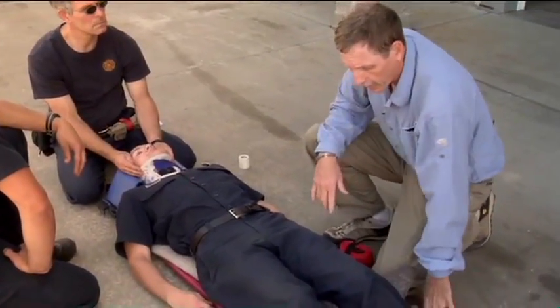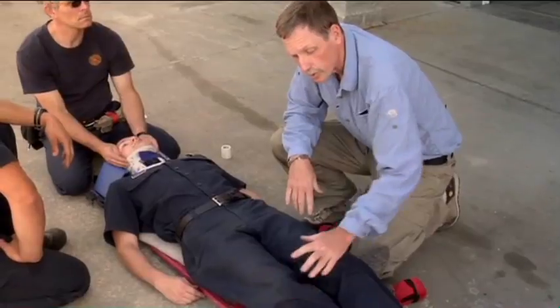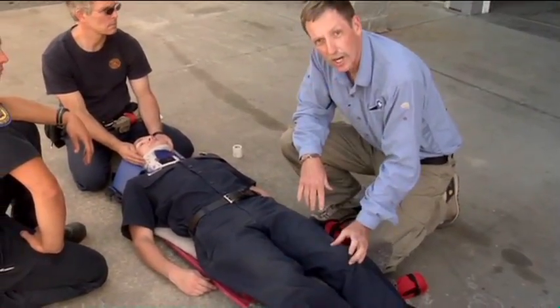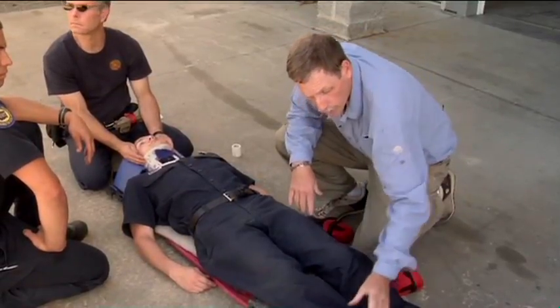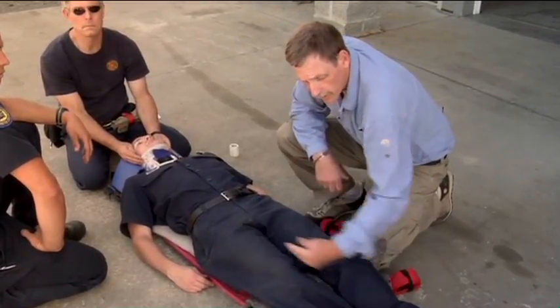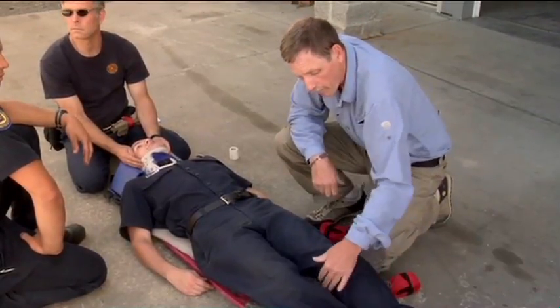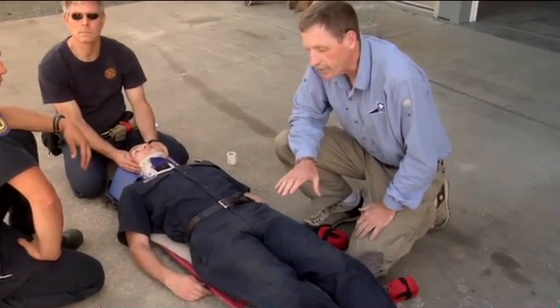The third area here is the lower leg weight center. Now the knees are sort of the wimpy band of the lower leg. We don't want to put any lateral straps across there because that's going to injure the patient. So what we'll do is we'll put lateral straps below and lateral straps above, and the whole knee area we're going to have diagonals. And as long as we have some padding under the knees with a slight bend in the knees, we're going to have a very, very tight patient.